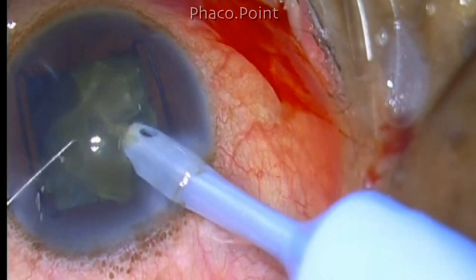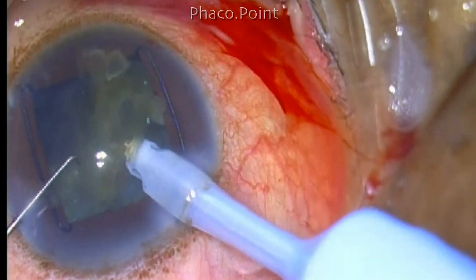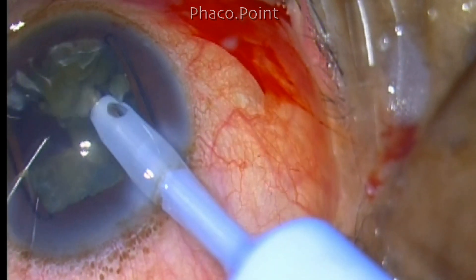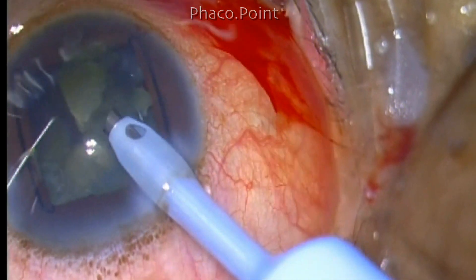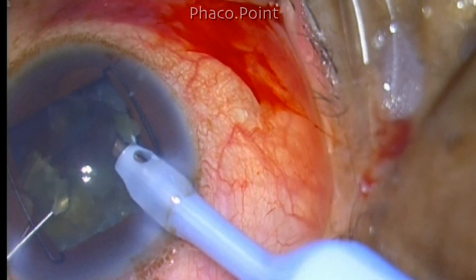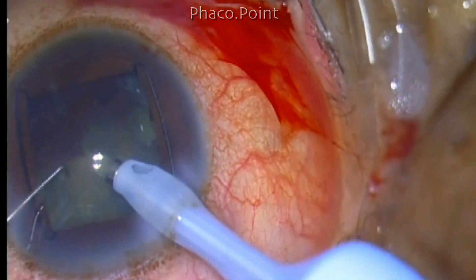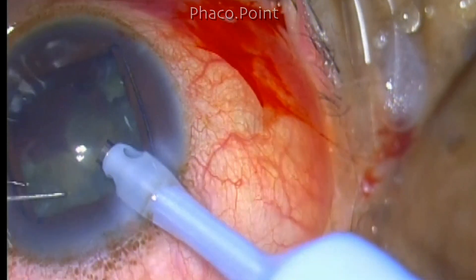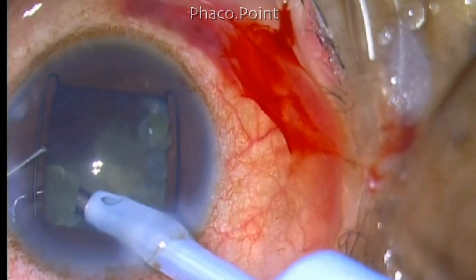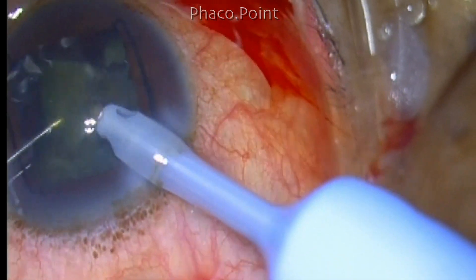Once the piece comes free and moves into the central zone, phaco emulsification is performed. The advantage of direct phaco chop is that you need only one setting — both for creating the chop and fragment removal — a single setting throughout the entire procedure. As you downsize fragments you may reduce vacuum slightly in harder cataracts, but with good foot pedal control and machine fluidics this is not necessary. I use a dual linear foot pedal system to control vacuum on the go.